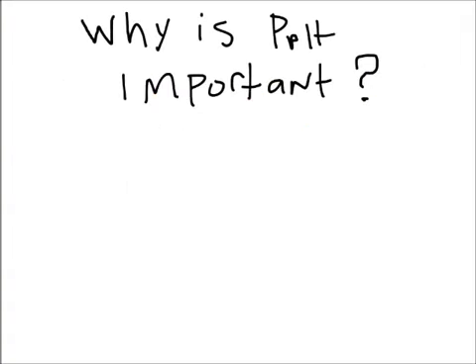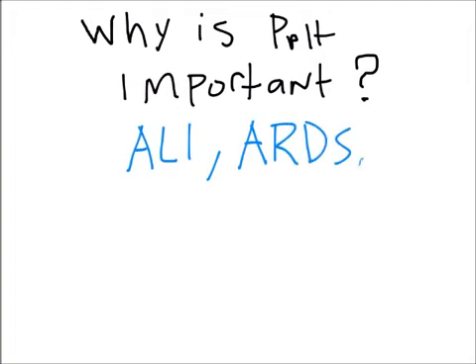Now, why is plateau pressure important? Plateau is important because it gives us a look at what the true alveolar pressure is. So we can use this diagnostically. It's used quite a bit in many protocols. It's used in protocols for acute lung injury or acute respiratory distress syndrome, and even sepsis protocols when we are mechanically ventilating the patient.